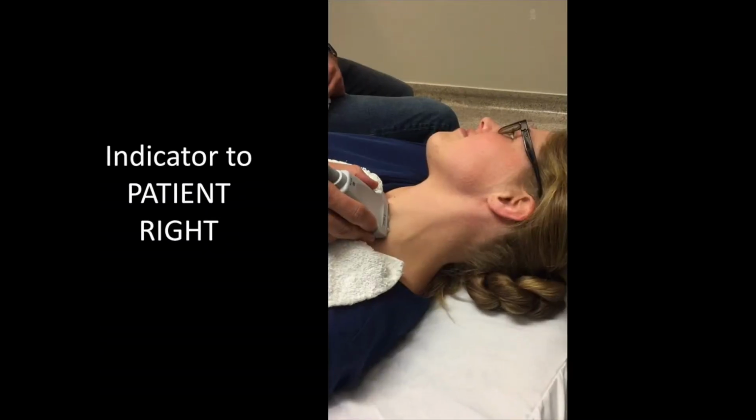So to do a carotid assessment, you're going to have to assess both of the carotids. Here we're starting on the left. Have the patient lie supine and just have their head turned just slightly to the opposite side of the carotid artery you want to assess. You don't want to over-rotate them or the sternocleidomastoid will get quite taut and it'll push your probe away.